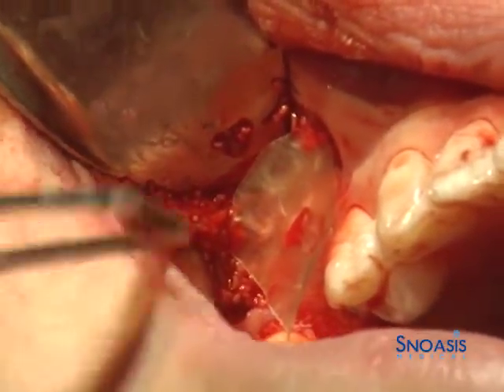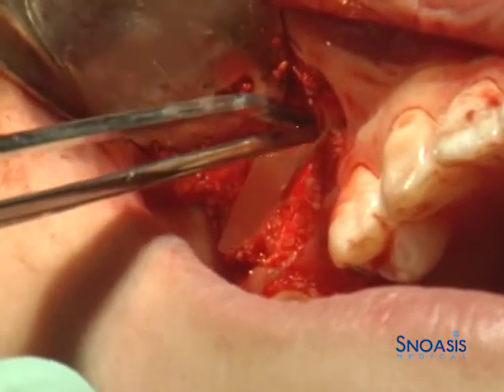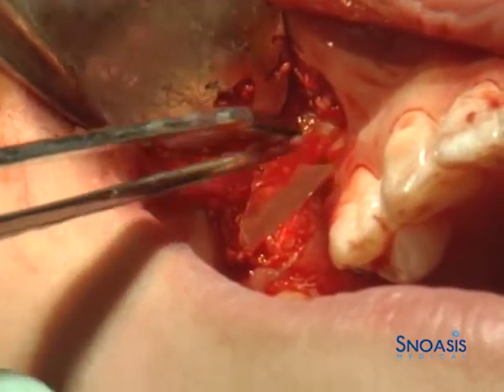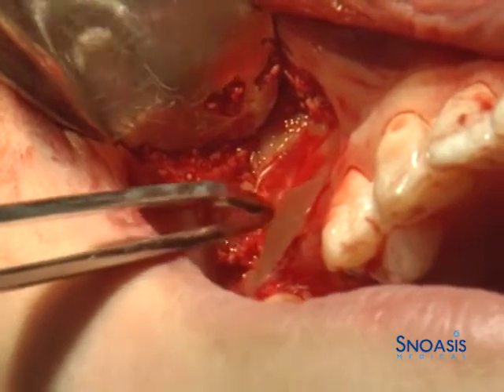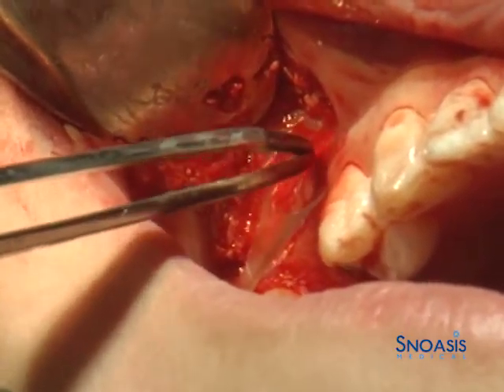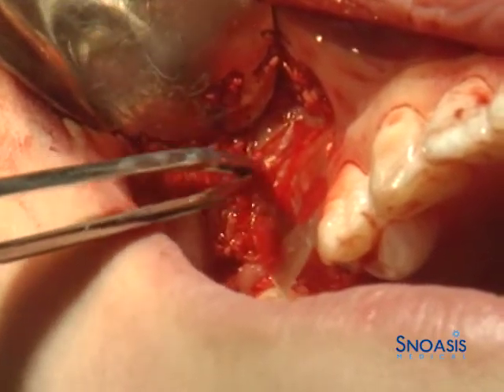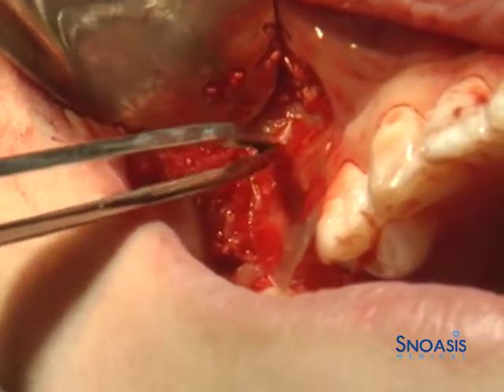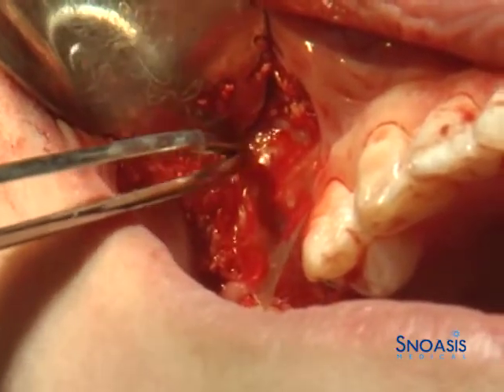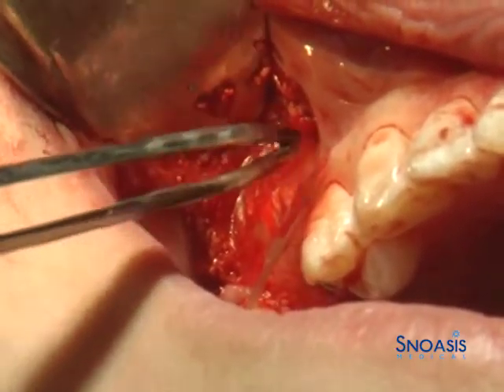Current protocols allow for minimal to no trimming of the membrane, as it can be folded upon itself. This image reveals contact with blood in the surgical field and initial hydration of the membrane, which allows it to stabilize and stay in place without any need for suturing. It is easy to manipulate the membrane to cover any grafted area and simply tuck or fold the membrane within the surgical field.